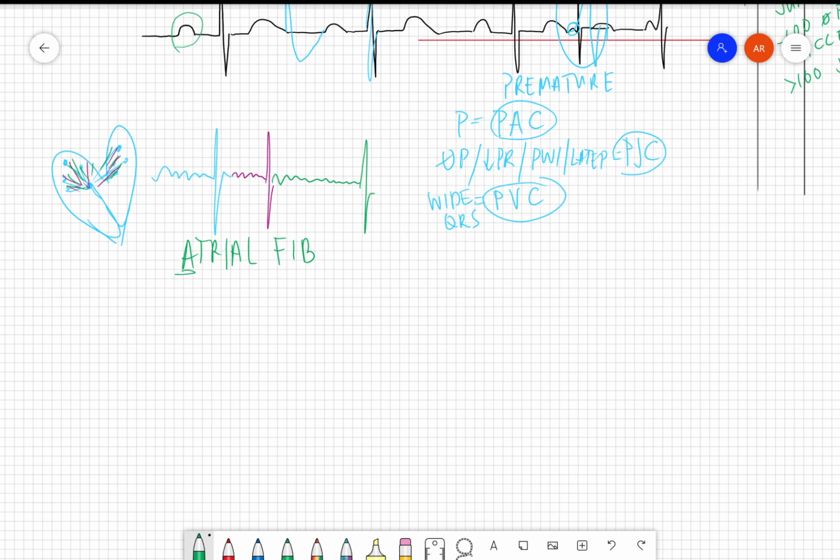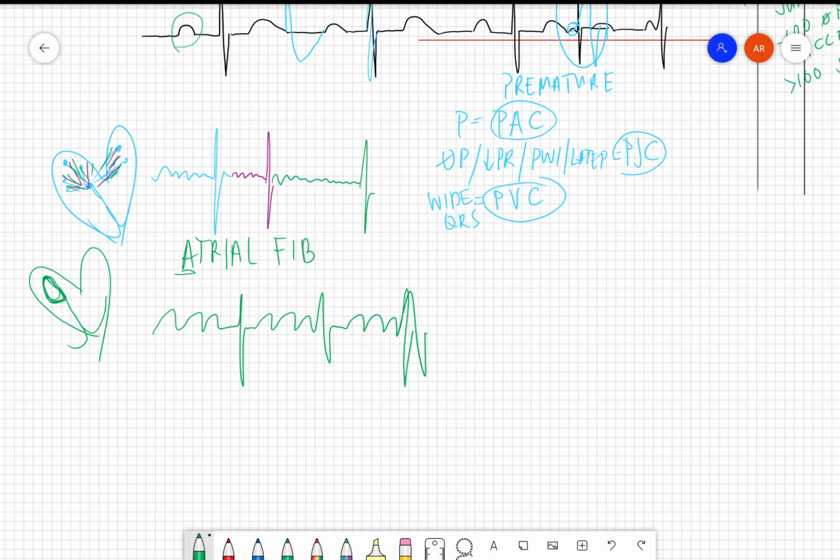We have another variation of this where we've got maybe a couple of wannabe shot callers. So what it'll look like is we'll have maybe one here, and the electricity kind of goes around in a circuit, like do, do, do, do, do, and then it goes through. That's supposed to be skinny, not wide. It's supposed to look like a sawtooth. I'm a terrible drawer. It's supposed to look like a sawtooth, and a sawtooth rhythm that's pretty regular, like the regularity of the QRSs is pretty even. Like you've got three sawtooth teeth between each one, and each beat's coming on time. This is what we would call atrial flutter.